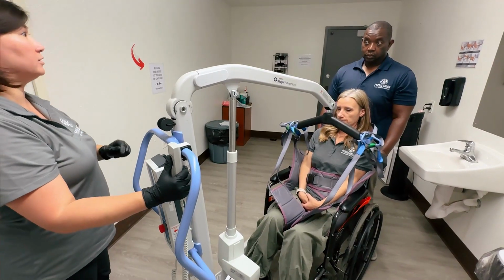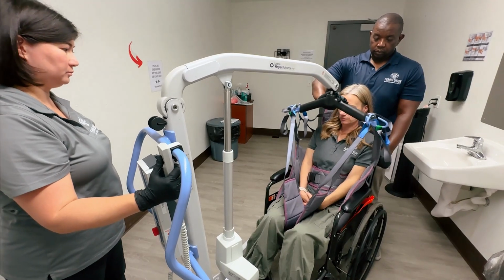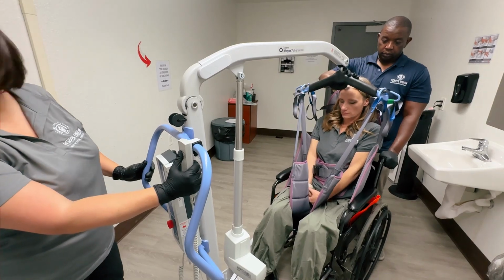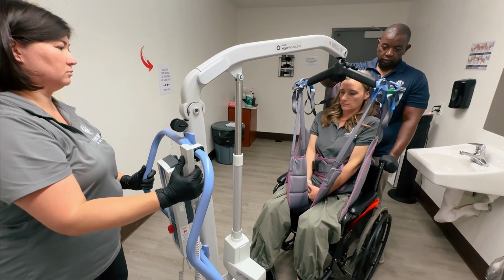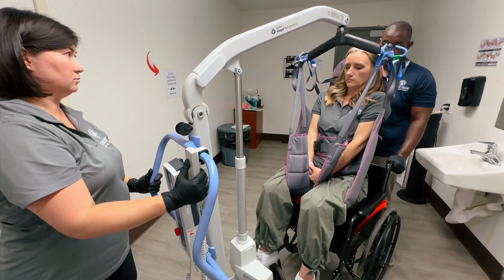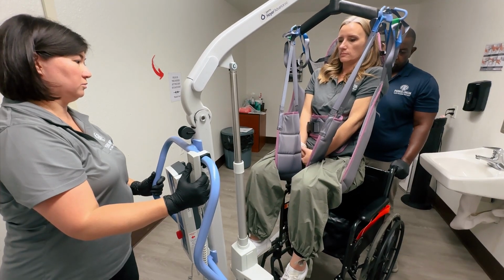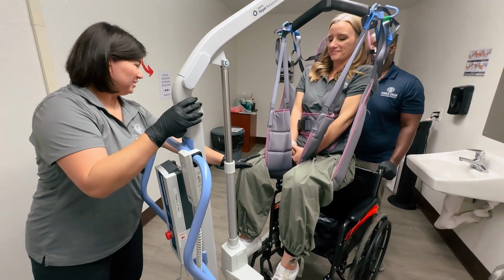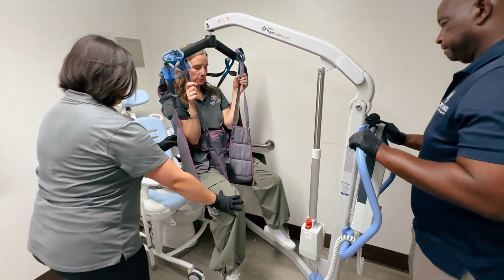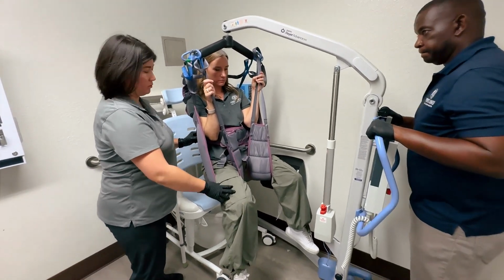Begin lifting the student with the Hoyer lift. If the student's backside slides down through the sling, it is probably because the leg straps need to be moved further up under the thighs. Lower the student back into the wheelchair and reposition the leg straps higher towards the groin area. If the straps are placed correctly and the student is comfortable, lift and transfer the student over to the toilet. Transfer the student with one assistant guiding the sling and one assistant navigating the Hoyer. While the student is positioned over the toilet, proceed with clothing management.